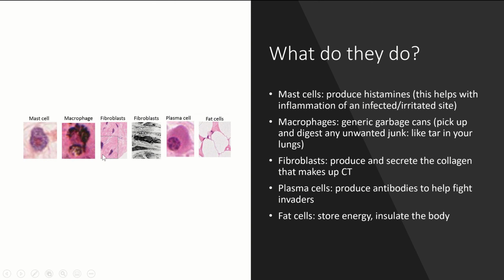Okay, so don't look at this and tell me that this is the cytoplasm of a fibroblast. This is not in a fibroblast cell. This is the collagen outside of the fibroblast cell. Okay, if you're confused with that, please feel free to ask a TA in help desk. But that is how collagen in fibroblasts works.